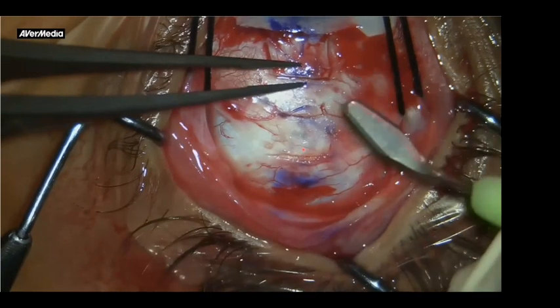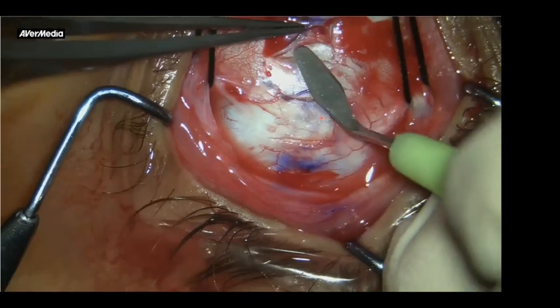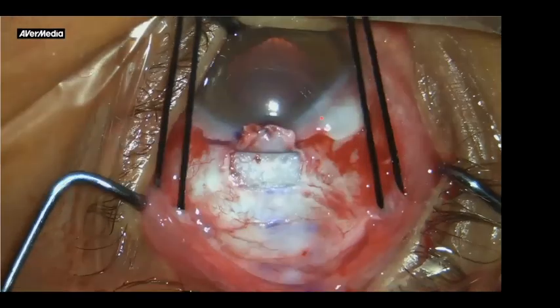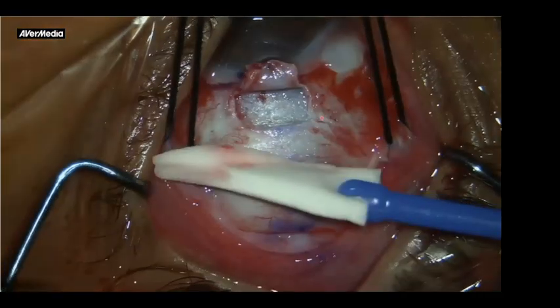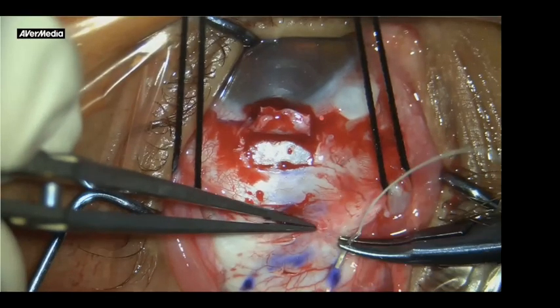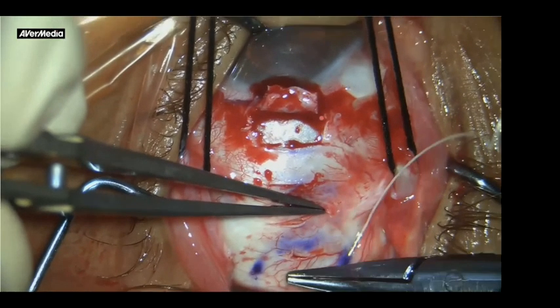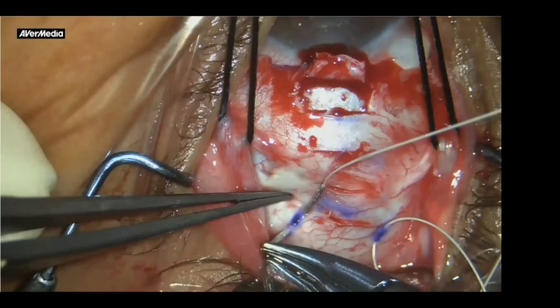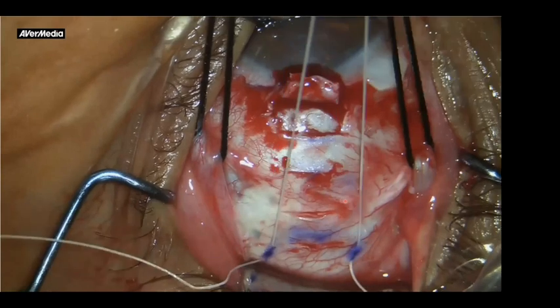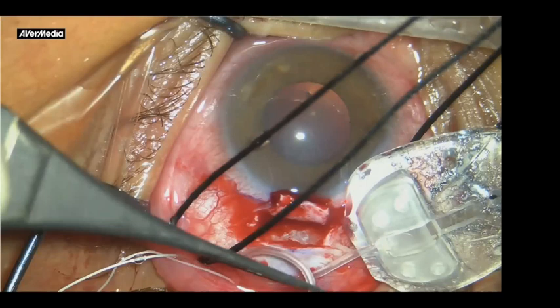And then going to the last part, it is a flap or a trapdoor. I know that some of the surgeons are just piercing the limbus and putting the graft on this. Again, hundreds of techniques are available, but I dissect the flap, and then every now and then I make the field dry, and then I'm putting the non-absorbable sutures. I know there are some schools which are using absorbable sutures, and some schools which are not using sutures at all. But again, I'm using non-absorbable sutures because the implant can migrate.